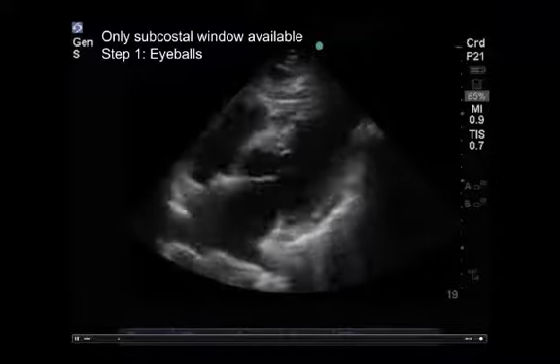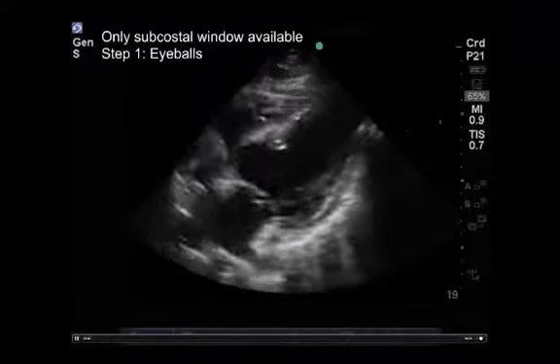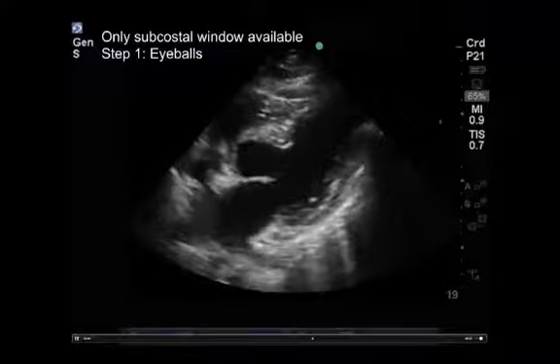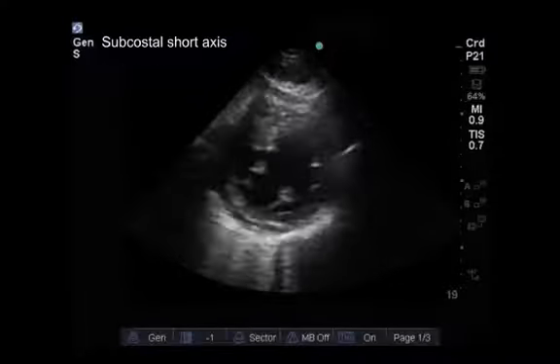and so it makes me suspicious there's pathology there. As well, I note that there's something odd about the septal appearance here, but tying this all together, given the history of pneumonia and ARDS, is not immediately evident, and this isn't consistent with the clinical history we're shown, so we're going to go deeper.